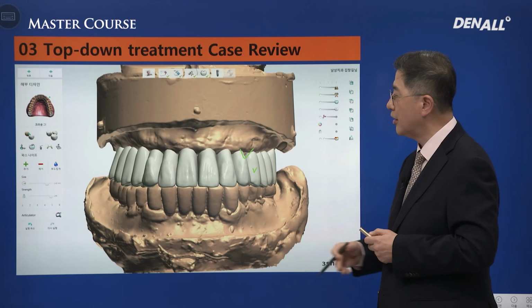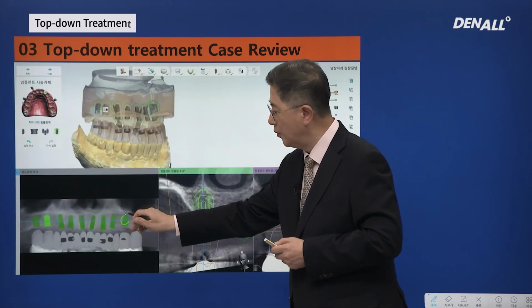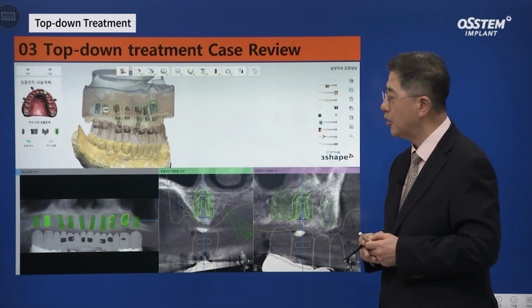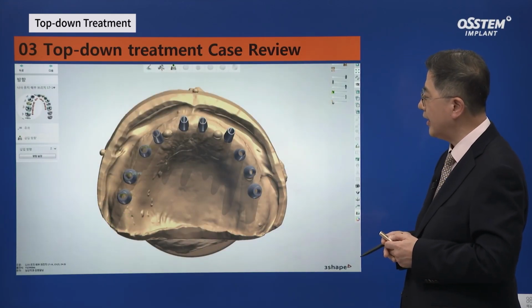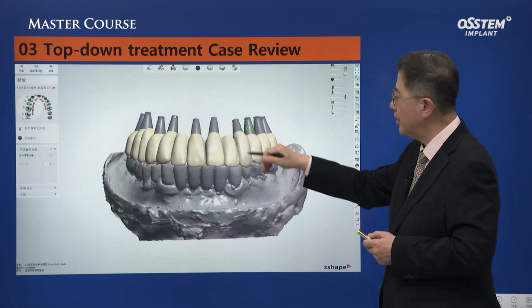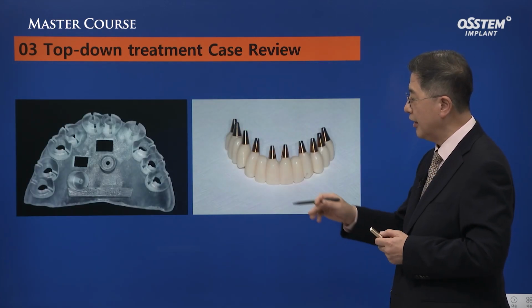Implant placement position is evaluated and provisional is designed along with abutment. Temporary abutment and prosthesis are fabricated. Guided surgery is utilized for implant surgery.